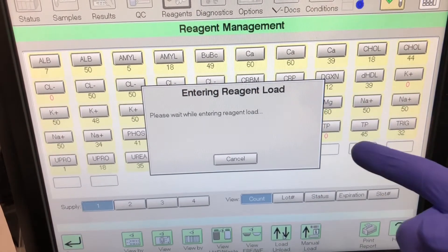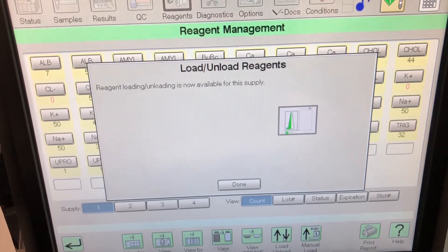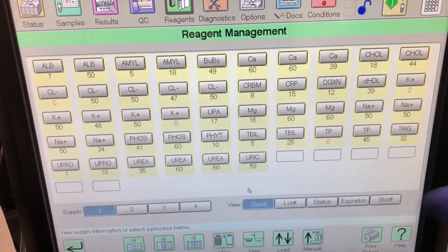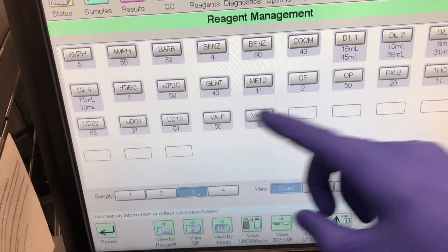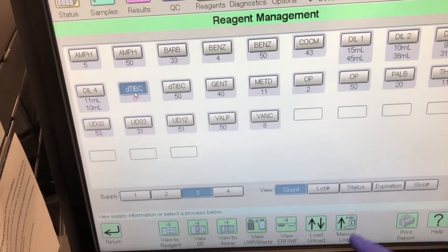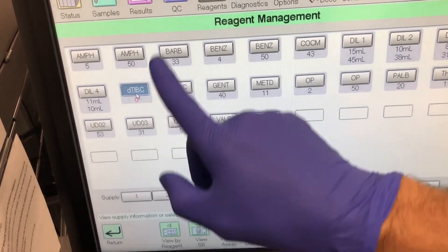Once you select that you want to load and unload the reagent, it'll take a second usually, and then it'll tell you when you can go ahead and remove the reagents and add the reagents. From here you can also see where it's empty — you can choose specifically to remove that if you click on it, and you can unload and load.